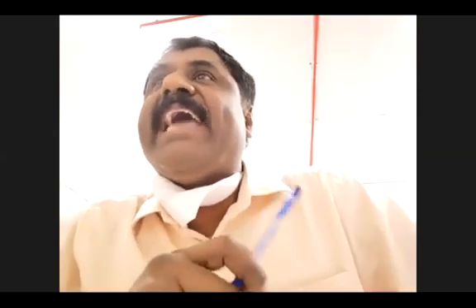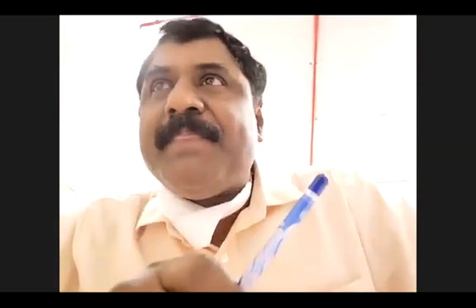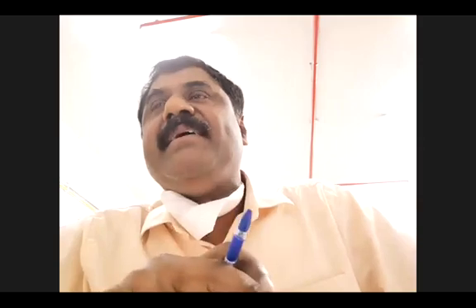So based on how much time the gas flows and how much that 400-degree heat has come down, that will be calculated and tell the VT, how much tidal volume is in or out. Pressure is calculated, everything is calculated.